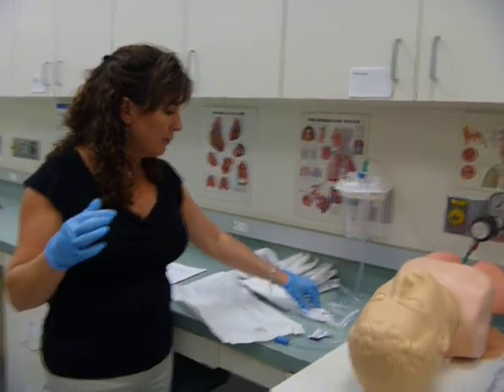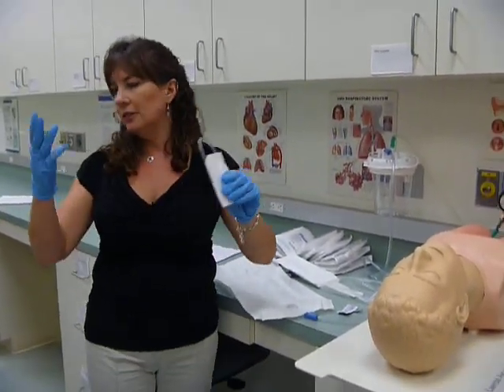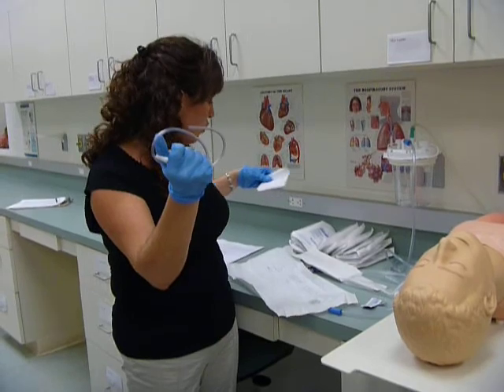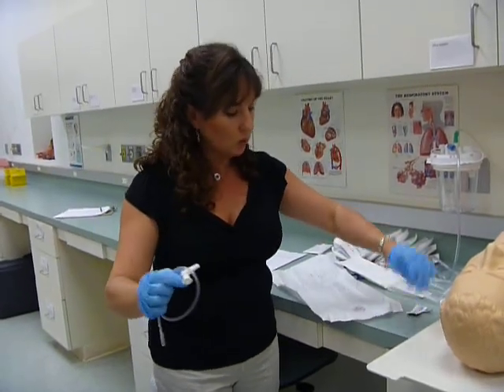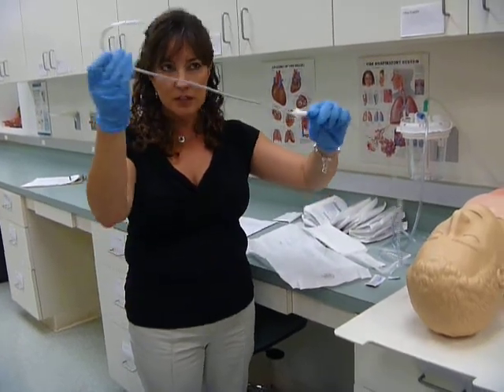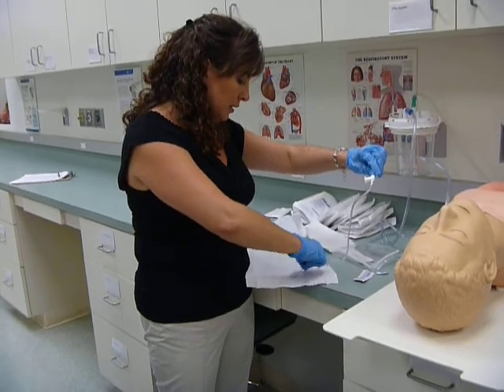Now I'm going to grab the package with my non-dominant hand. I'm right-handed, so I'm going to grab the catheter. See how I'm holding the catheter? Hold it so you can control both ends of the tubing. See, now I'm going to be able to push it on. Now once I touch this, this hand's no longer sterile. Okay? This is my sterile hand. I'm going to lubricate my catheter.